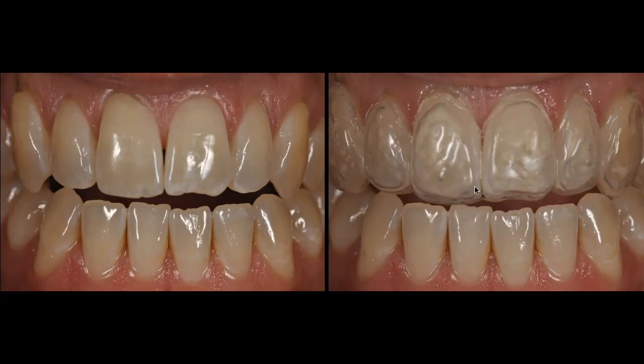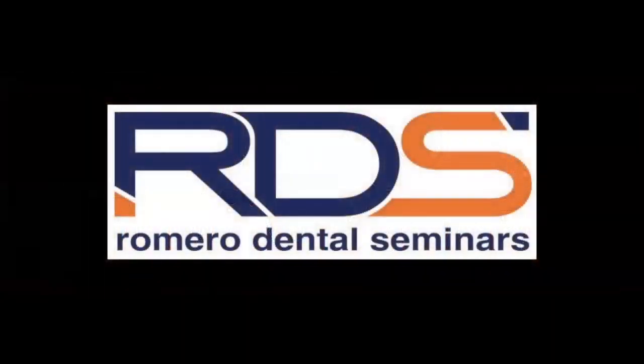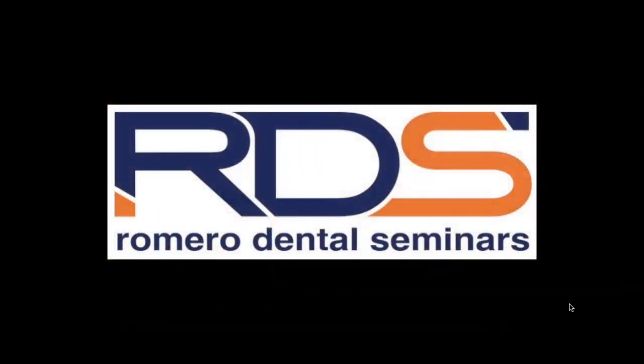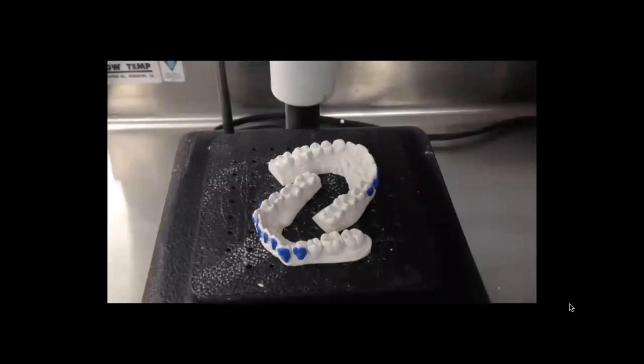So this is now the fitted tray, and I'm just going to show you a quick video here on how this whole process goes, how we go about placing the reservoirs on our cast. And you can see here we have our reservoirs on both casts. We're light curing these reservoirs, and once they're cured, and again, we just try to keep them 1 millimeter to 1.5 millimeter thick.